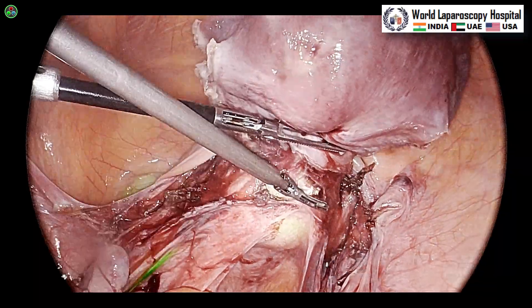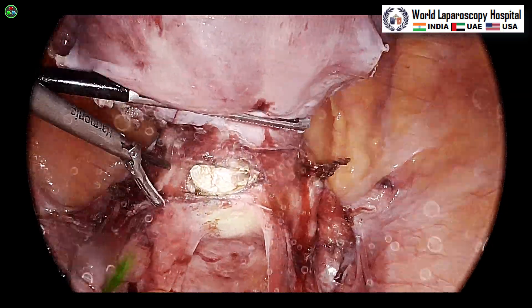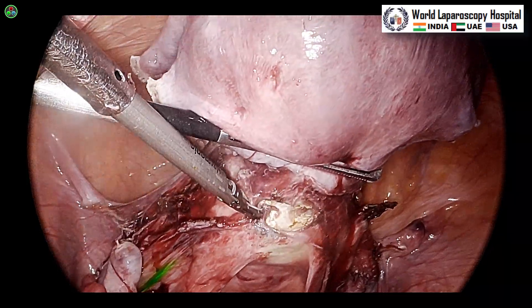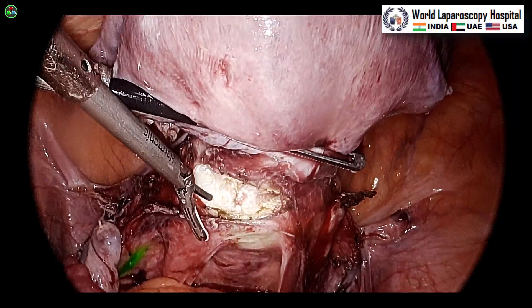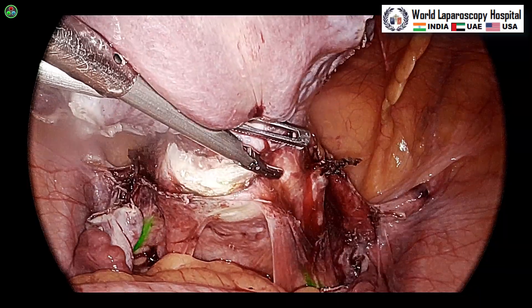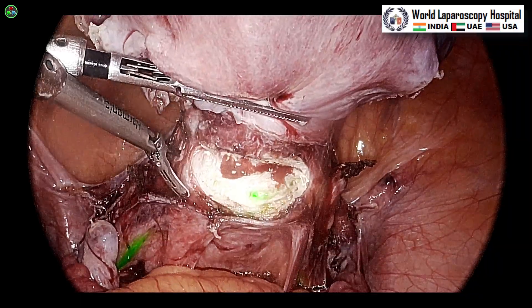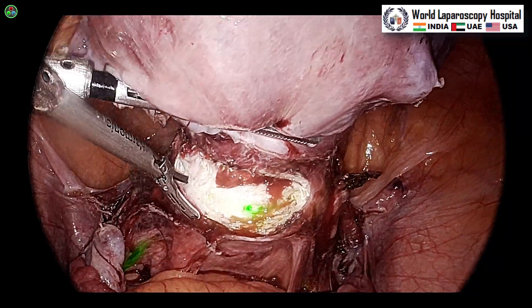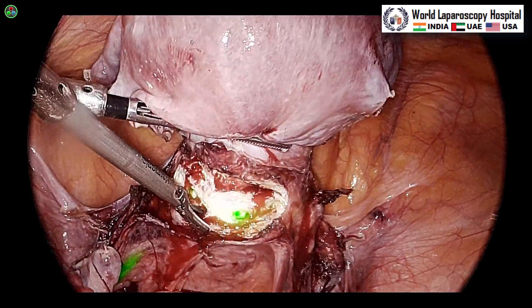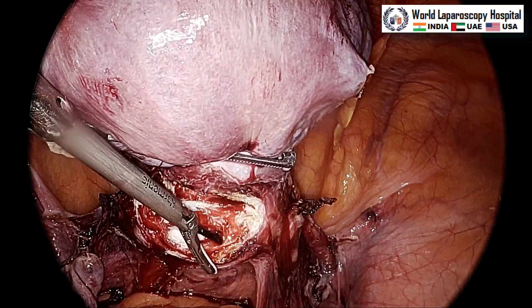In the 1688 camera in ENV mode, the surrounding bowel, rectum, or other structures sometimes gave a false green signal, but that does not happen in the 1788 camera. Another advantage of this camera is the OLED monitor which provides better contrast and better black levels. There is also a CSI mode where the vessels and veins of the bladder are nicely visible, which can be used for finding neovascularization and other diagnostic purposes.